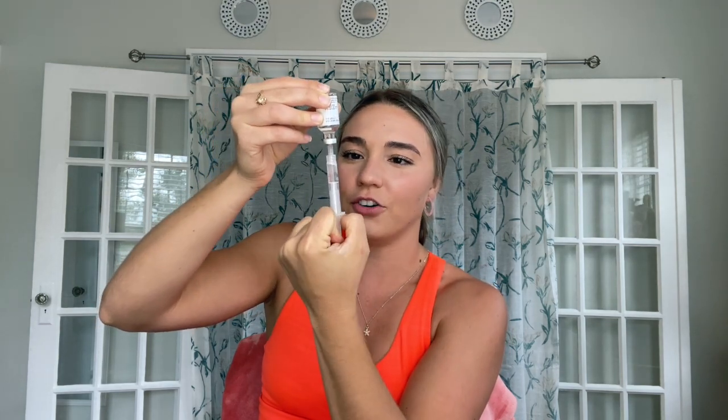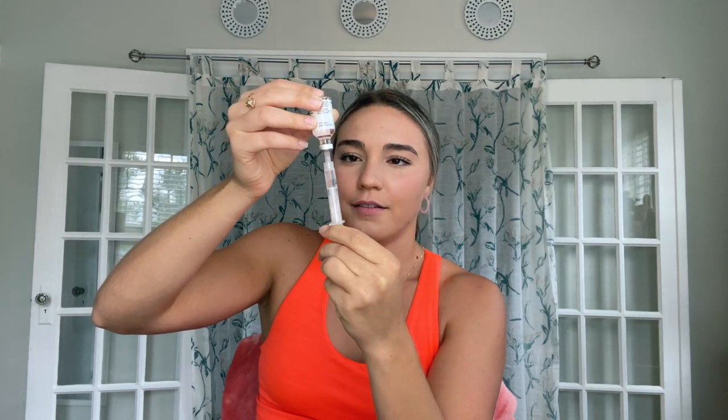Now we're going to draw the insulin out. I usually put in about 120 units into my pump — that lasts me about three days. I usually have a little bit left over, and unfortunately you can't draw it out once it's in the pump, but I'd rather have a little extra than run out of insulin somewhere. Fun fact: I used to be pre-med, now I'm pre-law, but I really could have flexed this skill. Now we're going to get the air bubbles out — flick it, the bubbles rise to the top, then shoot some out. That gets the air out — this is about 125 units of insulin.